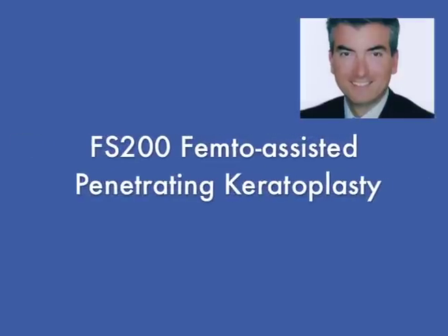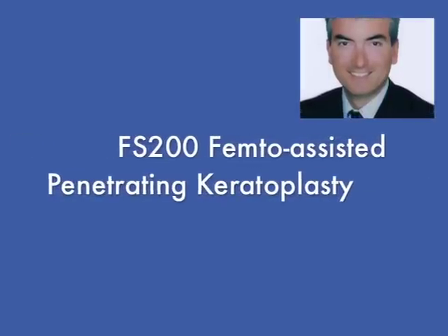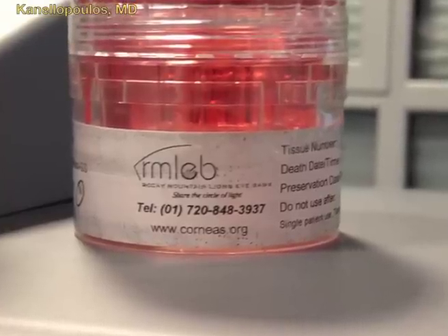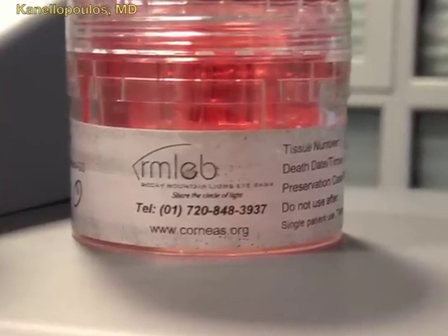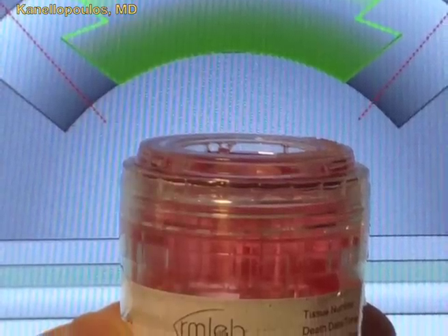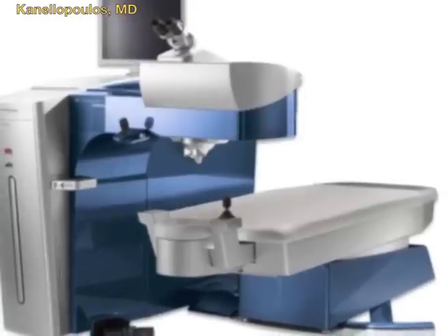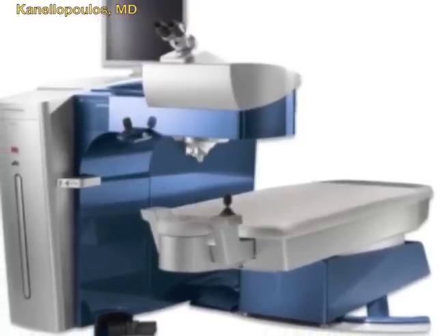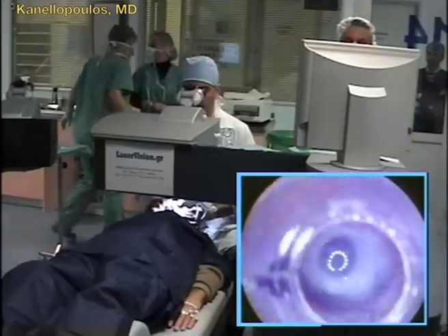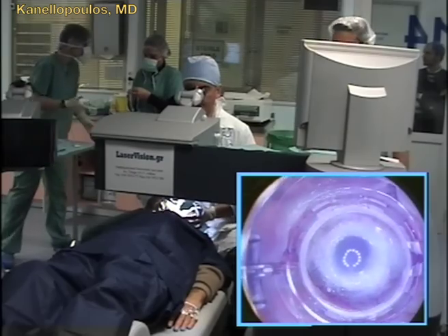Hello, this is John Canelopoulos from Athens, Greece. I will show you a fascinating application of the FS200 wave-like femtosecond laser. As you can see here, we are designing a penetrating keratoplasty with a side zigzag cut. This is the FS200 femto here directly on the actual host.